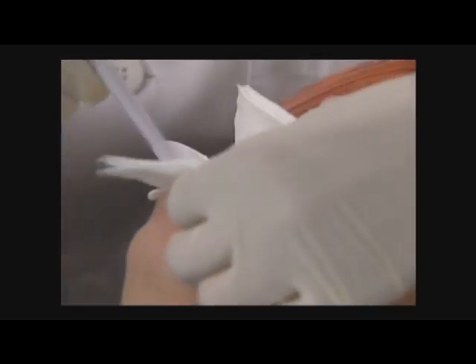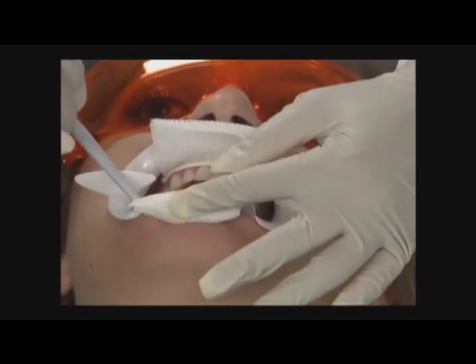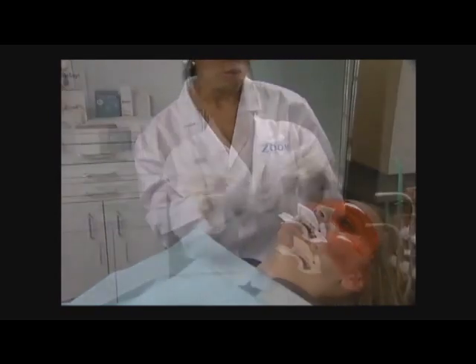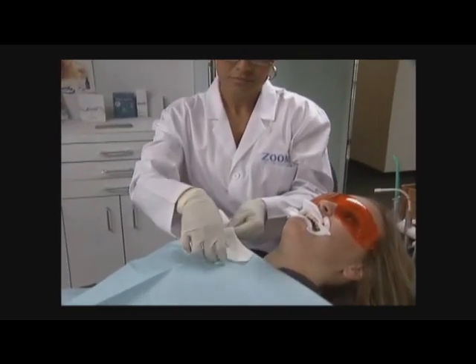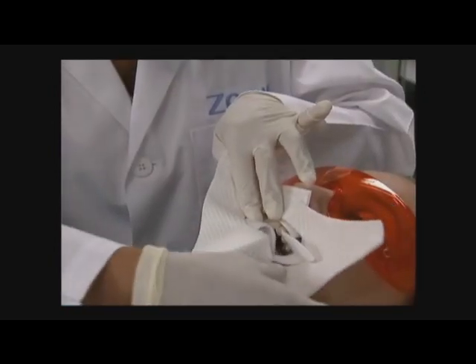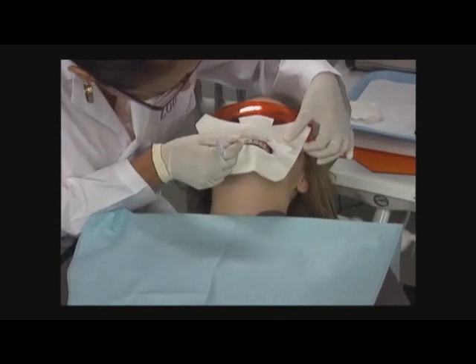Place the first piece of gauze fold side down in the upper vestibule, followed by gauze placed fold side down in the lower vestibule. Now place 2 face bibs around the retractor flange. Retuck the gauze into the vestibule if necessary.